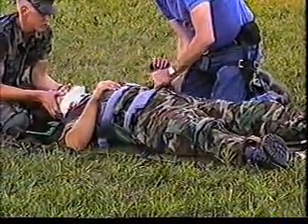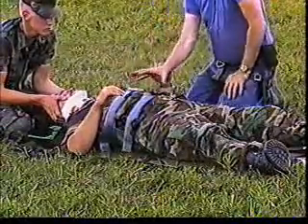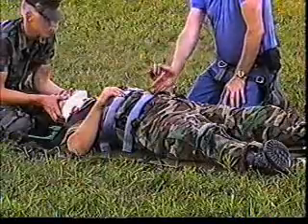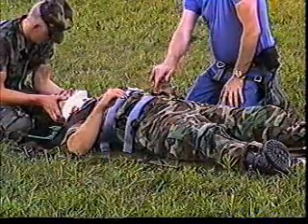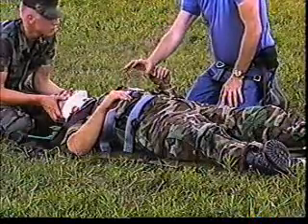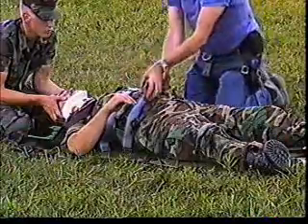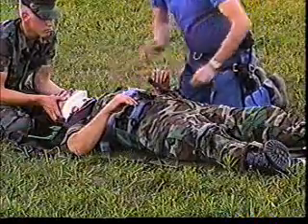Now bear in mind that we only need one of these body straps to do this job. So if he's got internal injuries, you don't want to fasten a strap over it, or if he's got a bad rib fracture or whatever, you don't want to fasten a strap over that. So we can leave one of these straps open if necessary.